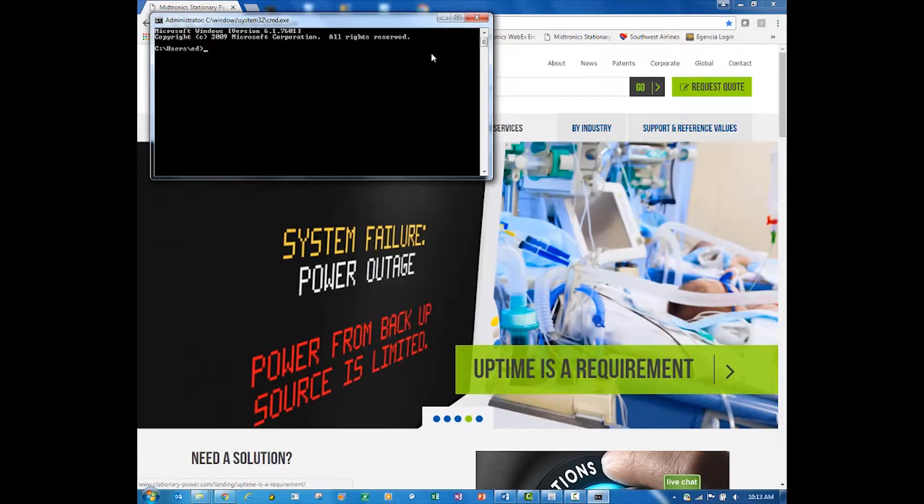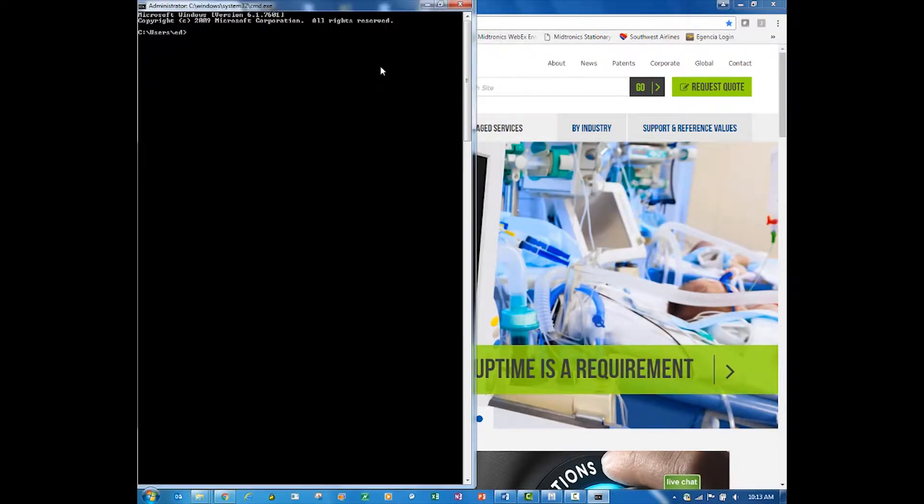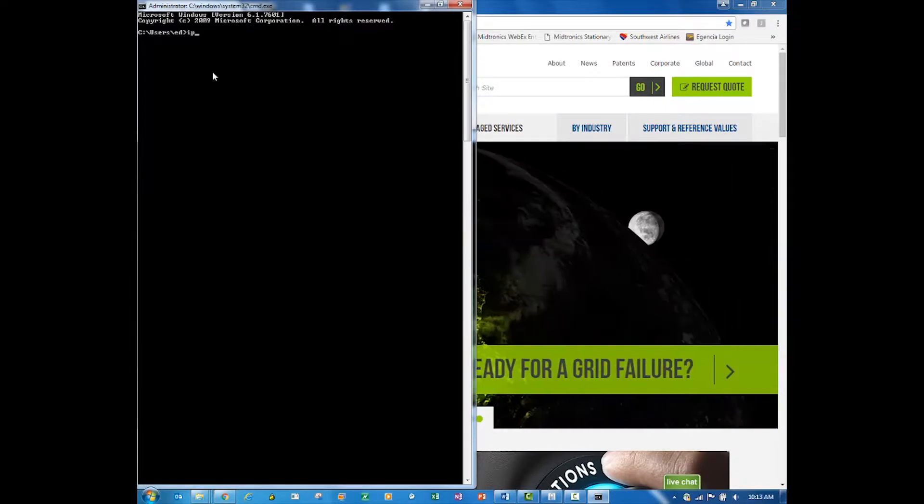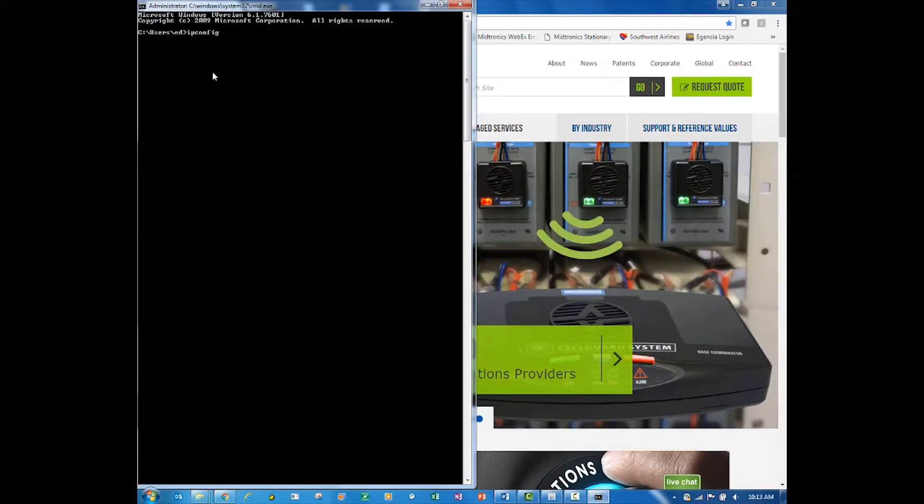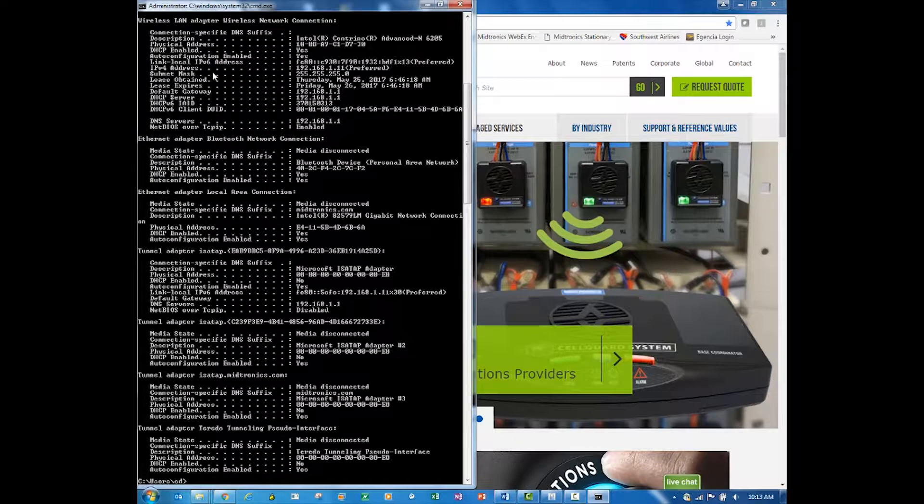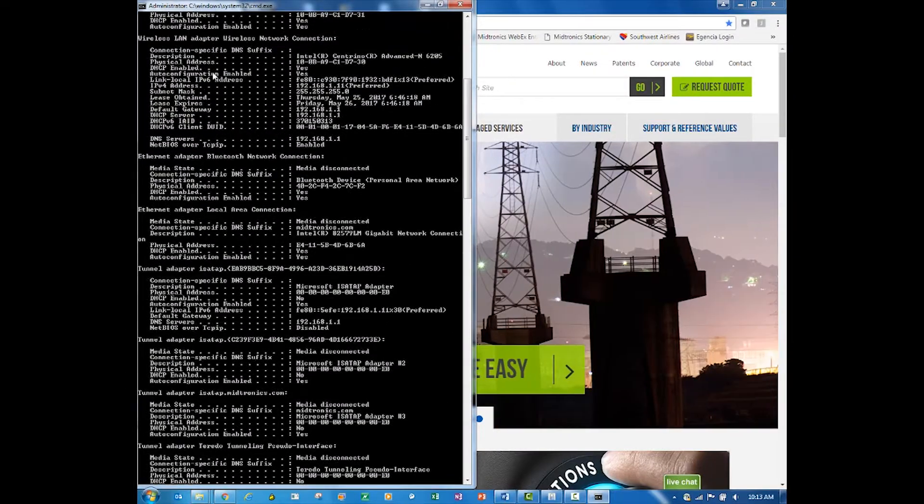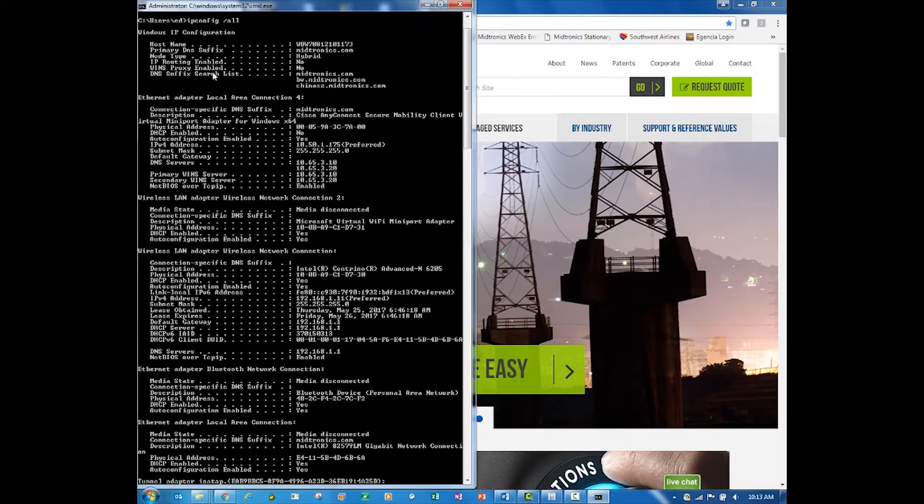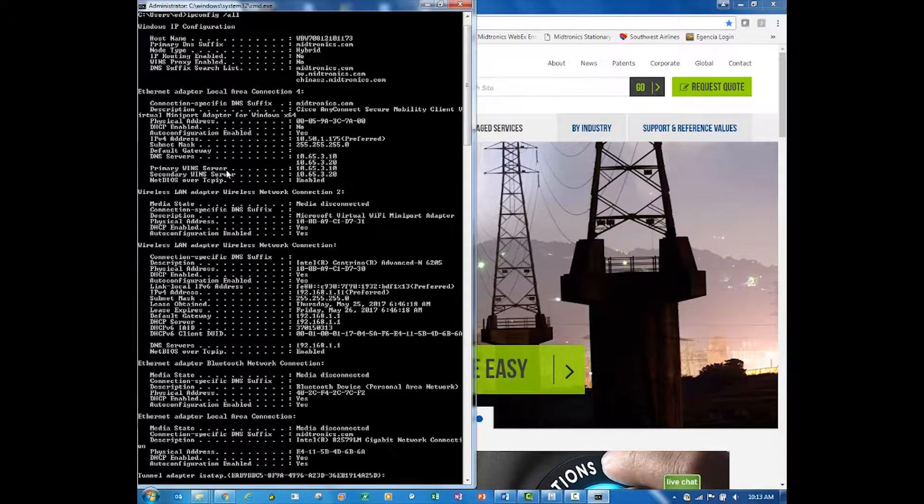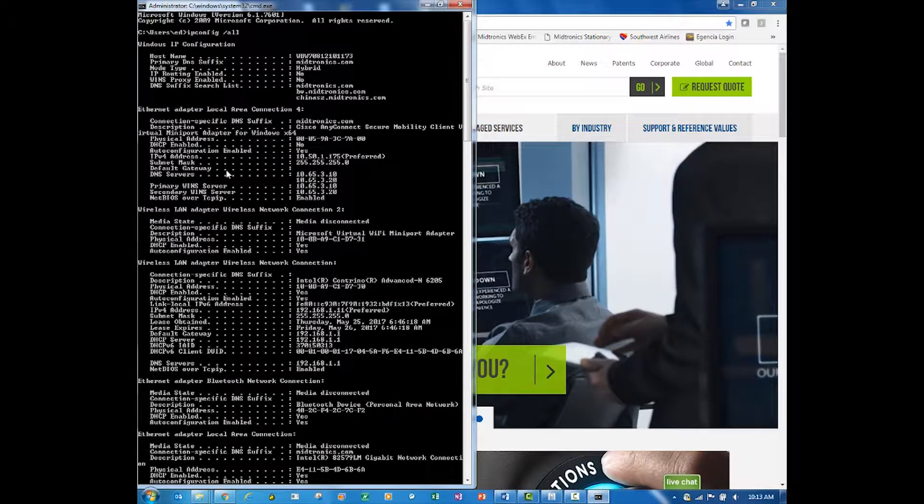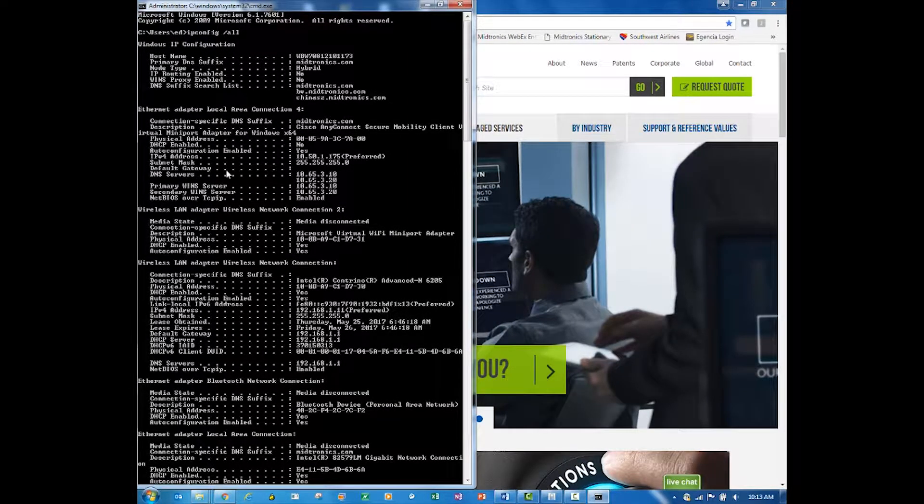I'm going to get the executable to bring up a command prompt, and then in that command prompt I'm going to type in ipconfig space forward slash all and press enter.